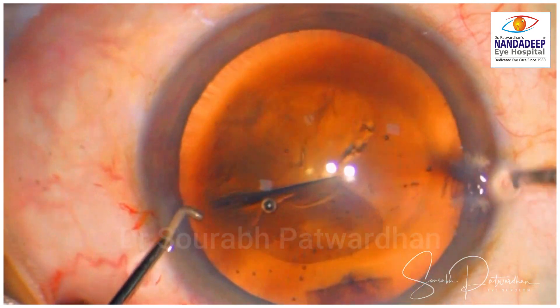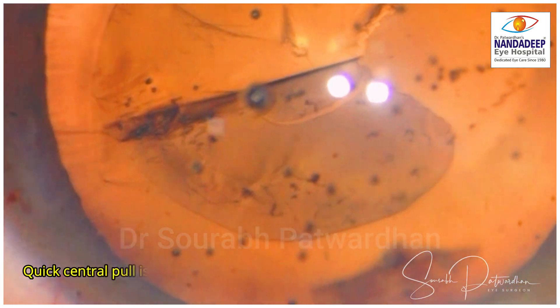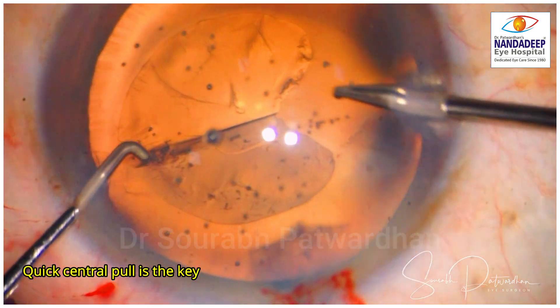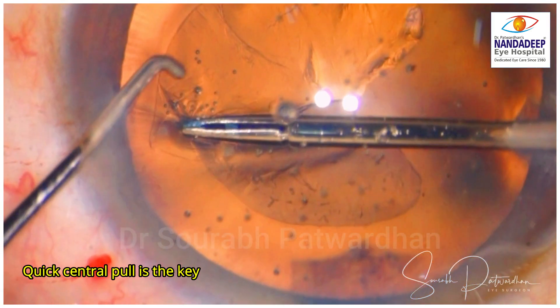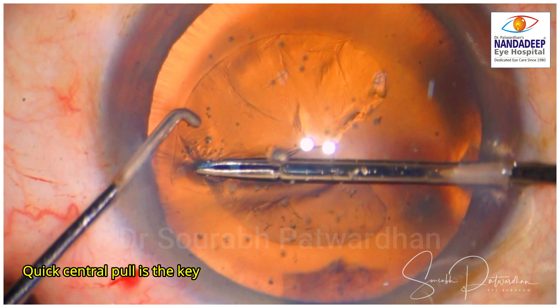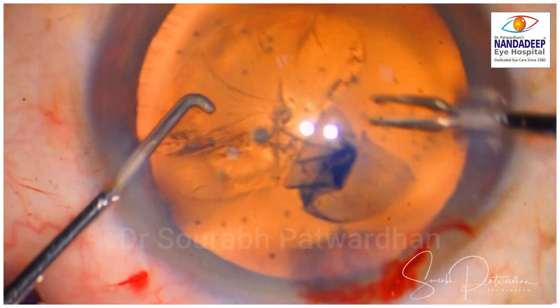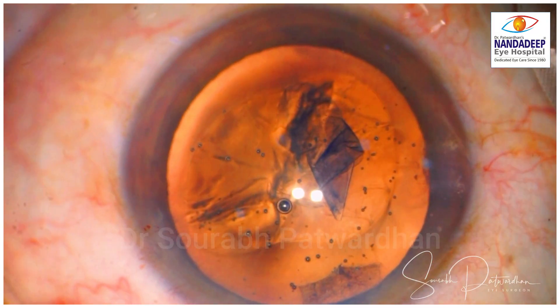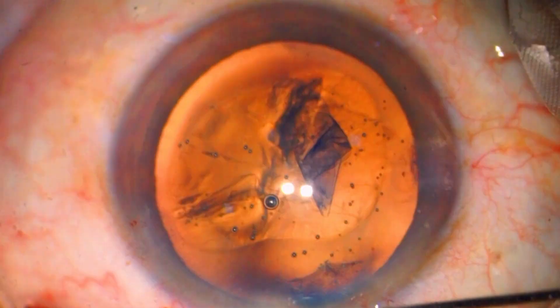The pull of the zonules can be negated only by a quicker pull, and that is what I am going to show now. The trainer takes over and decides to use the quick pull maneuver — just watch how it is done: holding the flap and quickly pulling it inside. You will find that it comes right from the zonules. This is the perfect technique of bringing back the capsulorhexis from the zonules almost to the edge of the bag. Apart from pulling it centrally, the swift or quick pull is necessary for bringing back this capsulorhexis inside.